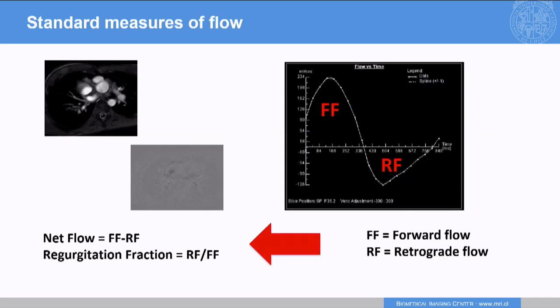So let me go back to one of the first slides of my presentation. When I talk to some clinical people, they say, Sergio, the community has come up with this amazing 4D flow data, with this amazing 4D flow sequence, but I really struggle to reformat all the data into the aorta, into the MPA, into the superior vena cava, inferior vena cava. It's really time-consuming, as Michael mentioned recently. And actually, I think people are right. We have come up with these crazy methods to quantify 3D parameters for 4D flow, but still we haven't come up with a tool that allows us to easily quantify the standard measures in 4D flow in a reasonable time.